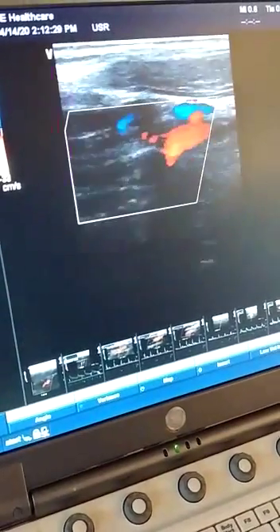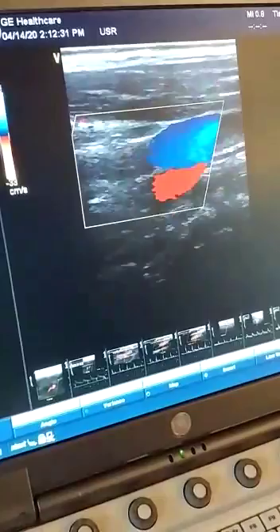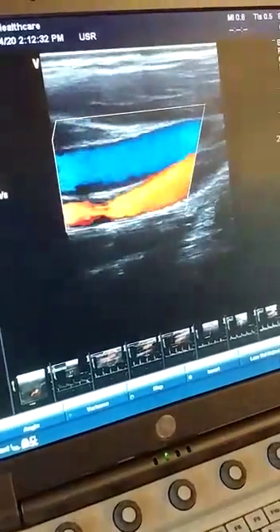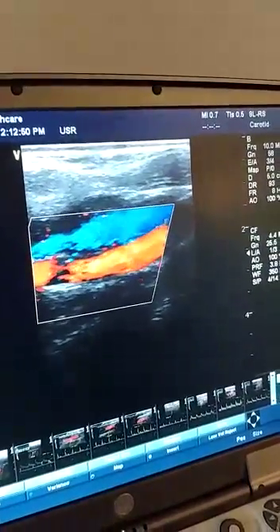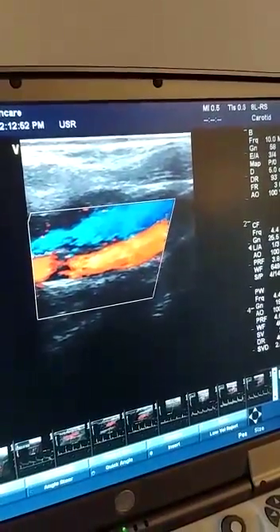I'm going to come out of that and go a little bit further up towards the head — that's me following the ICA. This is your ICA at the proximal. I'm swinging towards the head as high as I can, and of course after a while I'm going to hit the jawbone and it will be very difficult to get further into the ICA. So I'm going to get a waveform here of the ICA again. With the ICA, we expect a low resistance waveform pattern.